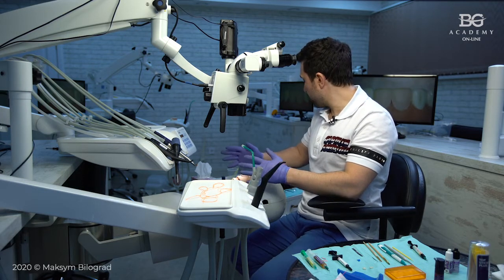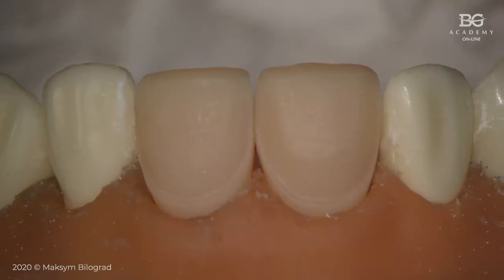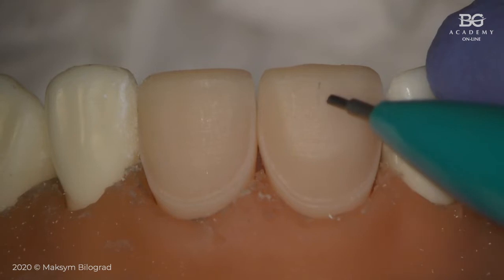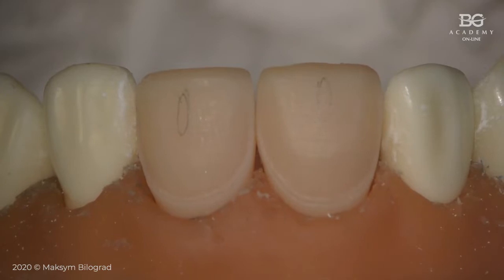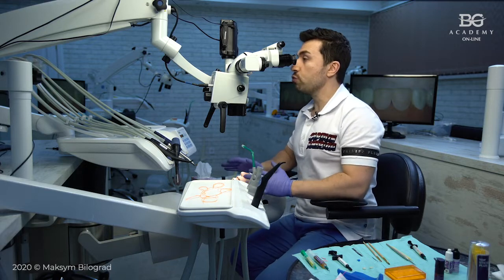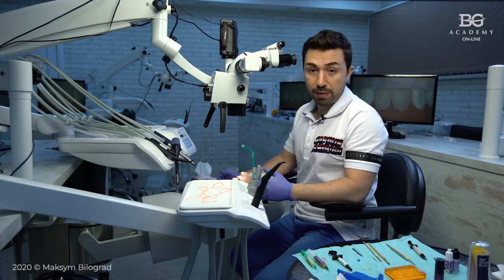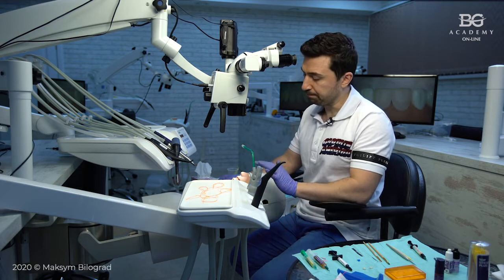But once I remove these provisionals, sometimes it happens that you may have some small increment of temporary material. Let us assume after you removed temporary veneers, where there was spot etching and spot bonding, you may have some small parts of provisional restoration that may influence the fit of your final restoration. To remove this, we use discs, like red or orange from 3M, or there is a better solution. You can use a carbide multi-bladed burr with a low speed, no water, just to remove it.